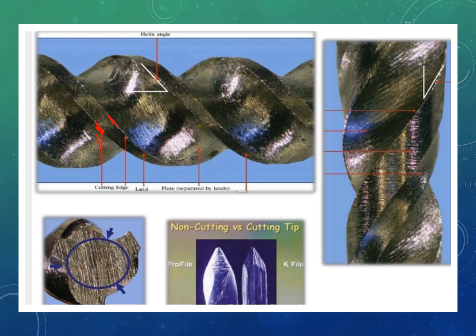So the rake angle, at your undergraduate level, what you need to understand is the positive rake angle cuts. The negative rake angle just scrapes, it does not cut. As of now, you just remember the positive rake angle cuts. The instruments having a positive rake angle cut the root dentin inside when it rotates. As I mentioned, these two are your cutting edges, and in between these two cutting edges, this one is called your land. These are just the names they have kept, so don't get confused or intimidated by this.